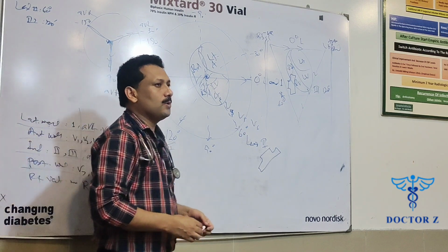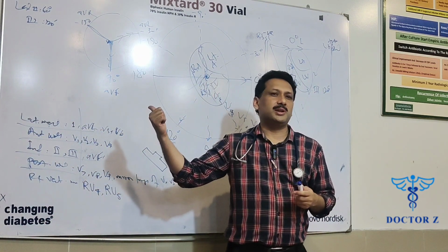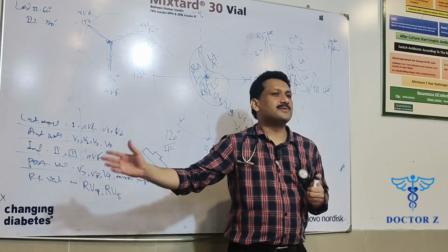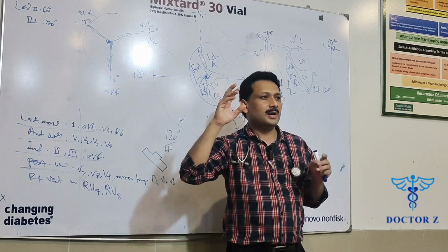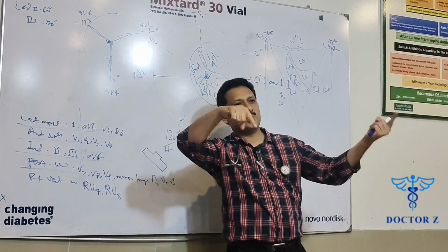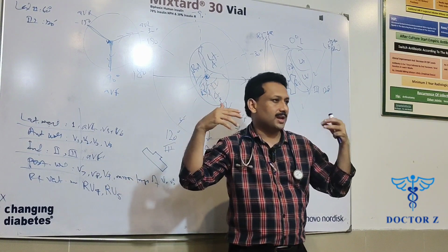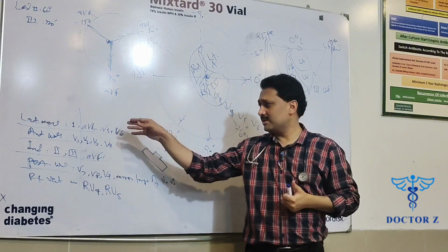We wanted to know about the 5 walls of the heart. We have the crystal clear picture here about these 5 walls. Now you must be having a really good concept of what the basis was, what the underlying reasoning was, what that electrode thing was, and what the physics behind it was. So this is what you are understanding here.